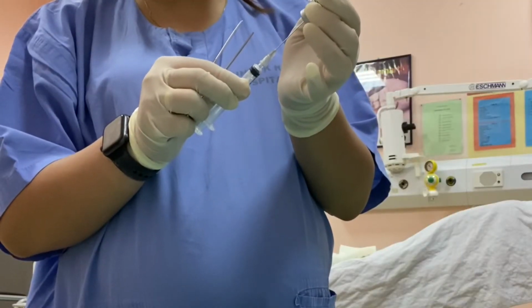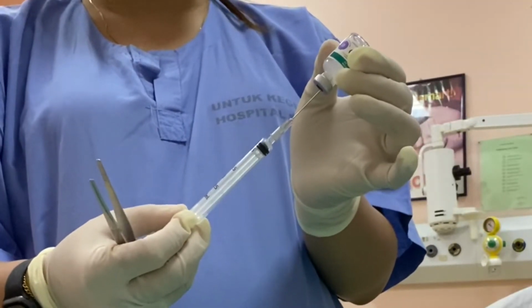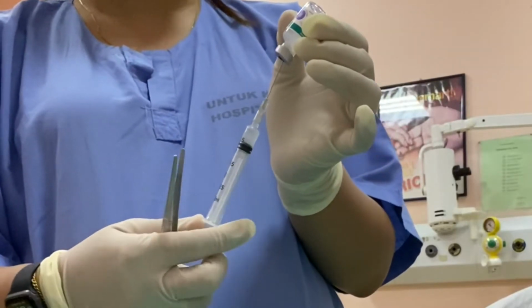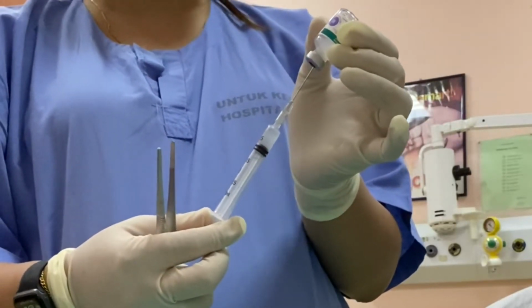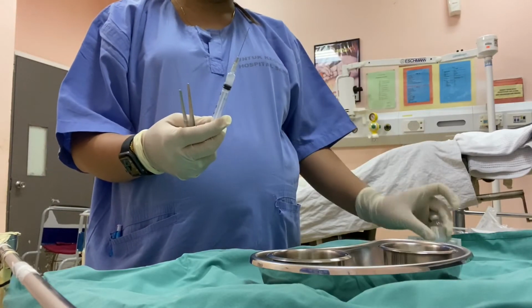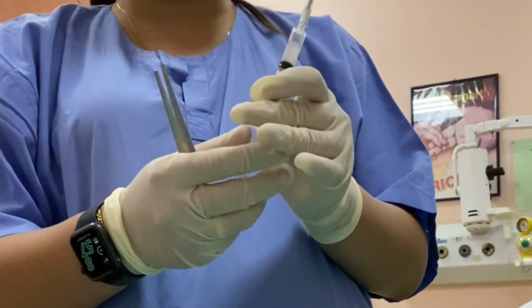We will draw it out according to the dose that should be given to the patient. So ATT will be given 0.5 mils. Clear up the bubbles.